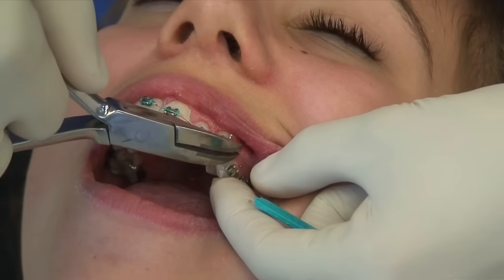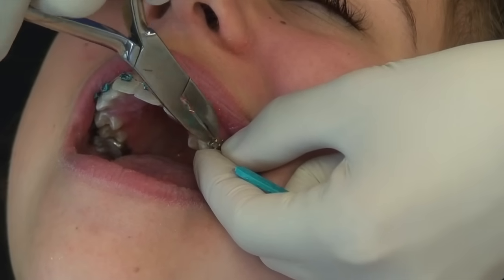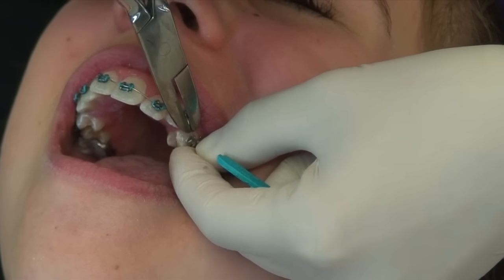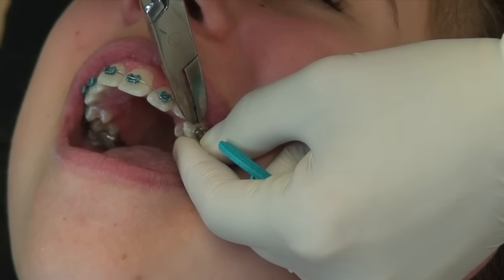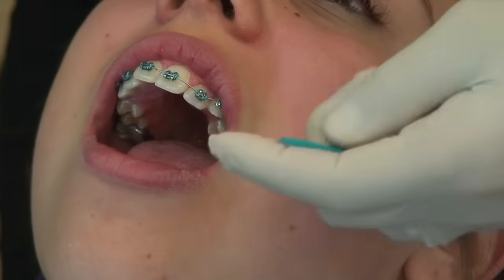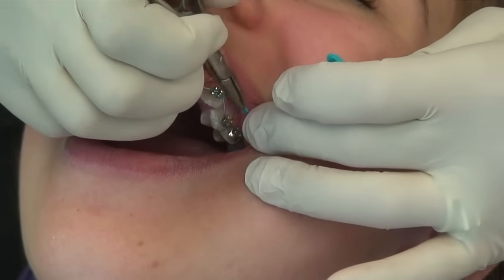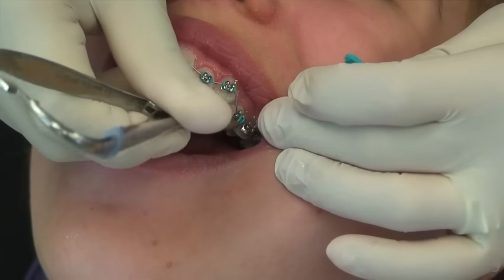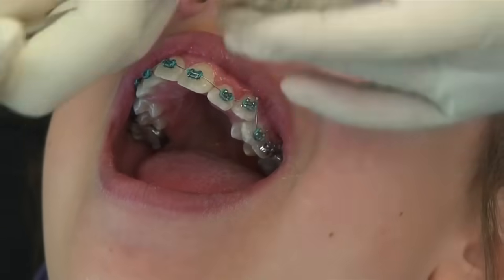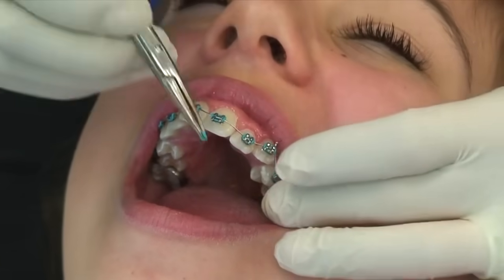And so really the braces are just a handle on the tooth. The ligature ties, those colored rubber ties, are nothing more than holding the wire to the handle, and the wire is what puts the pressure on the teeth and causes the teeth to move. Now, at this point, she feels a little bit of pressure from the wire, but again, it's a very light, flexible wire. We start off with real light, flexible wires and work up into heavier, thicker, rectangular wires. So the initial wire is very light forces.